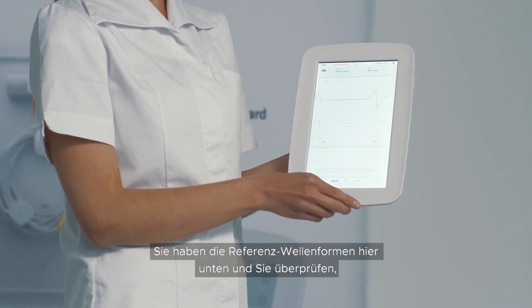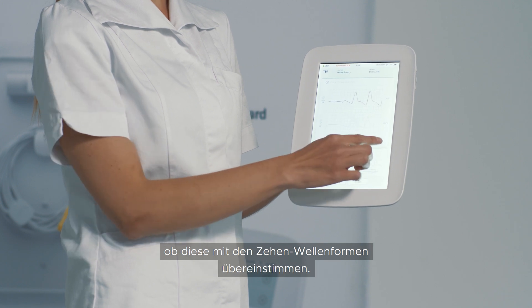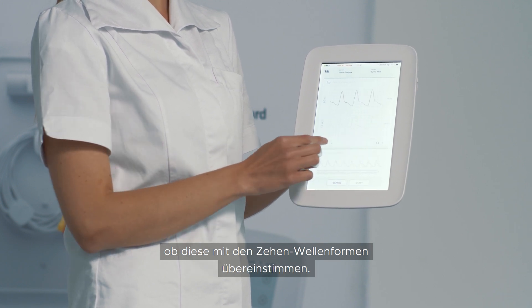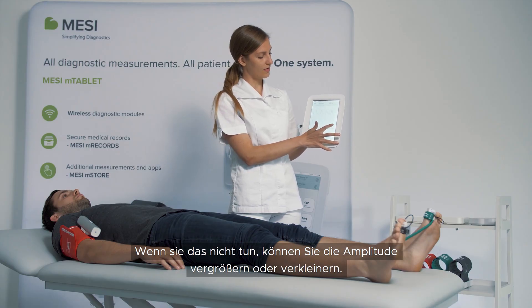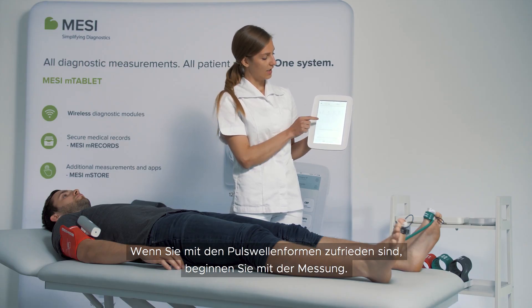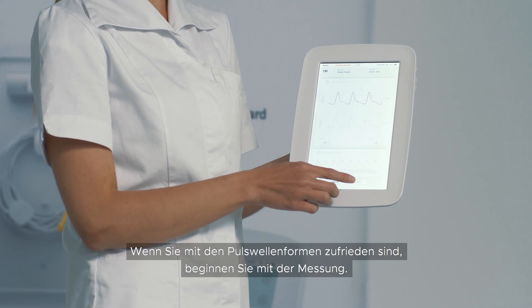First you have the reference waveforms down here and you check if the toe waveforms fit them. If they don't, you can increase or decrease the amplitude, and when you're satisfied with the pulse waveforms you start a measurement.